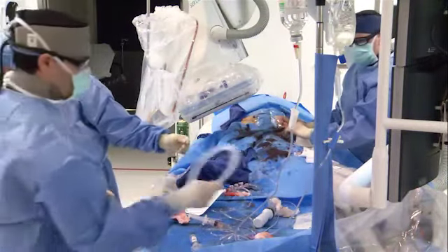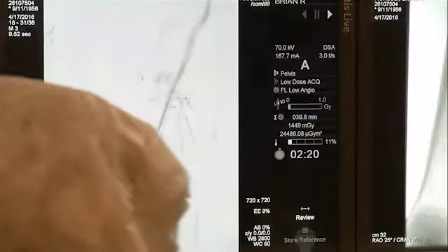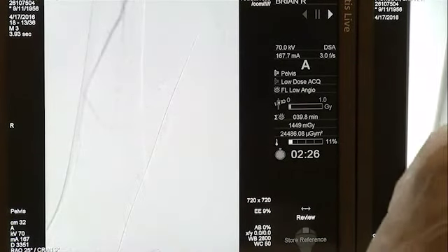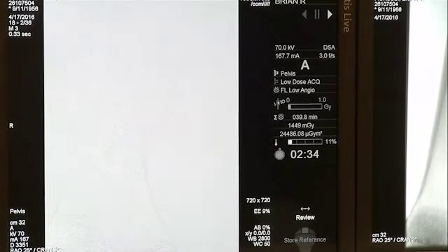One of the issues with directional atherectomy here is that trying to get that 7 French device all the way down to that area does concern me. And also the fact that the patient has one-vessel runoff and significant ulcerations. Well, he has two, I think. He has the AT and the peroneal. So this is... Yeah, the AT occludes, I'll show you. Go ahead.